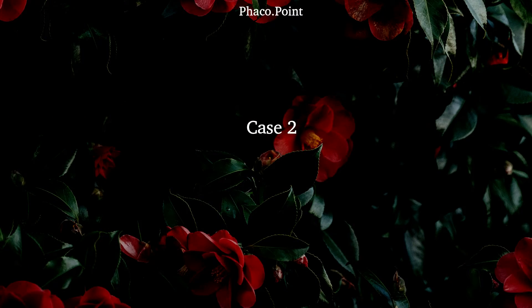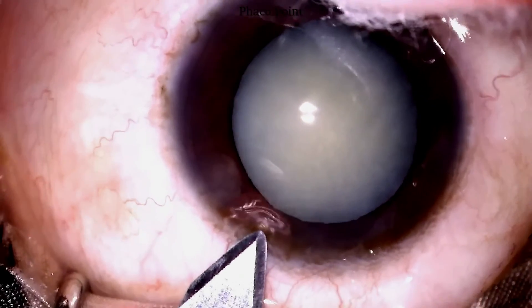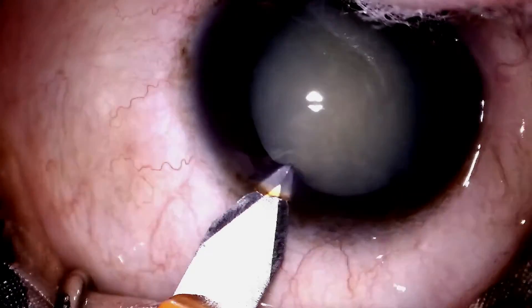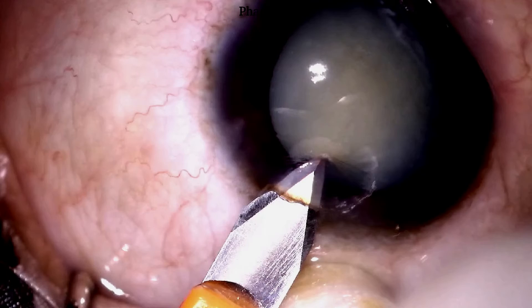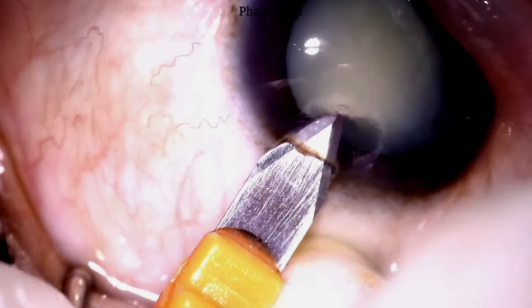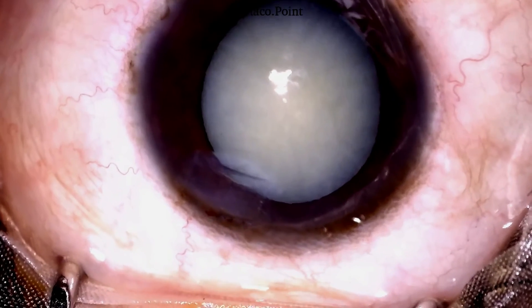Let's move to the next case. Note the starting point of the incision — I start my incision anterior to the brown palisades visible in the clear cornea. Having depressed the blade and engaged into the cornea, I then traverse the cornea for about 1.75mm. I now straighten the blade and pierce Descemet's membrane, entering the anterior chamber so that the parallel parts of the blade traverse the entire incision. Watch how I then remove the blade without any slicing movements whatsoever.